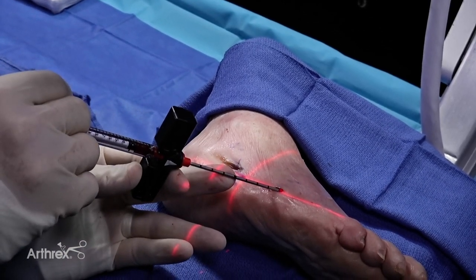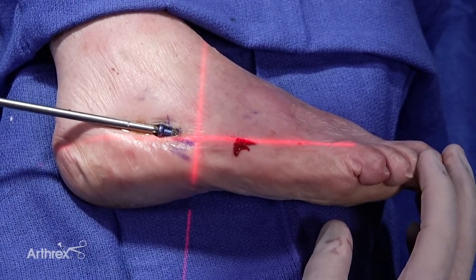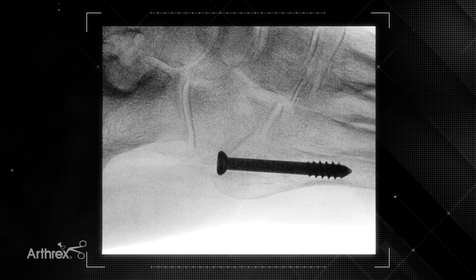At this point we're ready to advance the screw across the fracture. Once your screw is in place, you can then get final fluoroscopic shots of the construct.